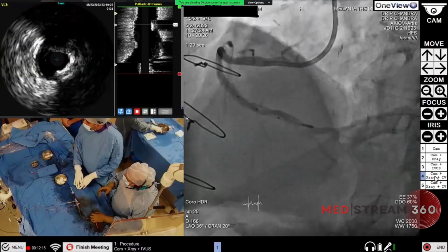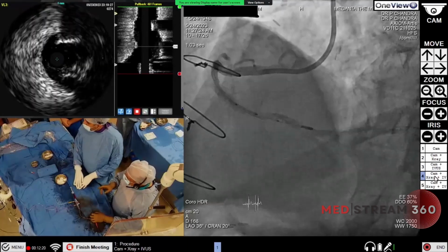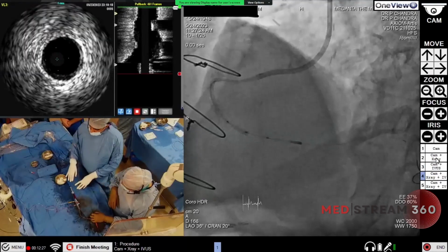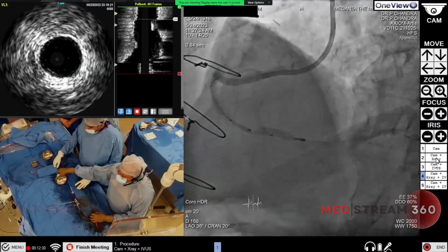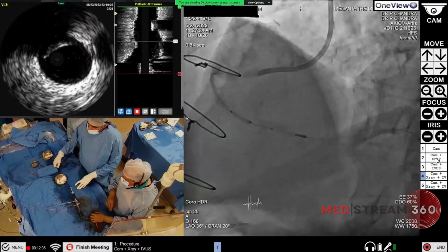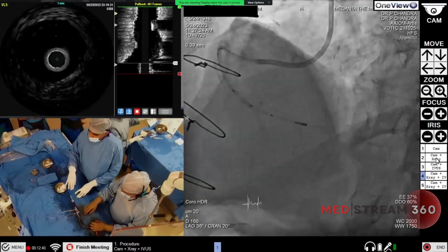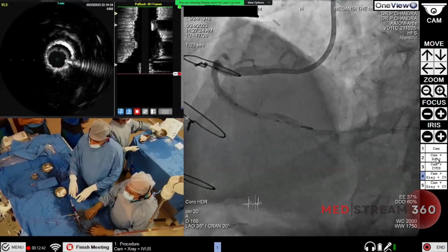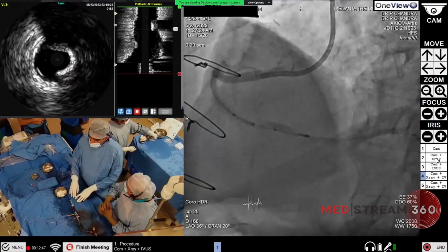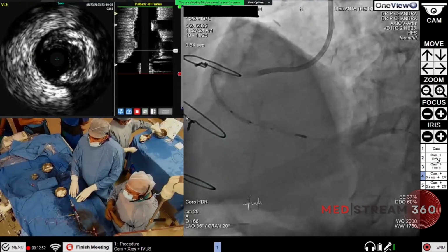Distal landing zone looks quite good, but there is a lesion beyond the bifurcation also, you saw that, and that is tight, calcified, and here also there is reasonable amount of calcium. So in this situation, we thought it will be better that we do a good therapy for these two lesions which are together, and we have planned to take a 3.5 IVL and then followed by most likely a stent. We will see. We are open to a drug-eluting balloon also, because there is a branch there and we might like to protect it.